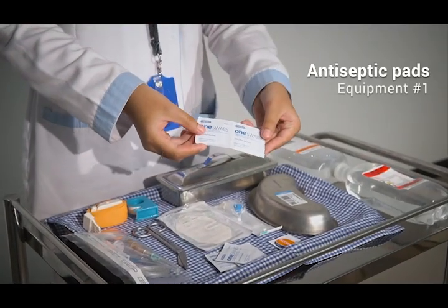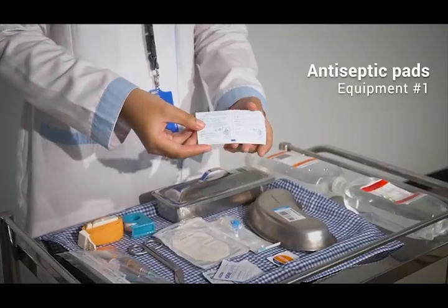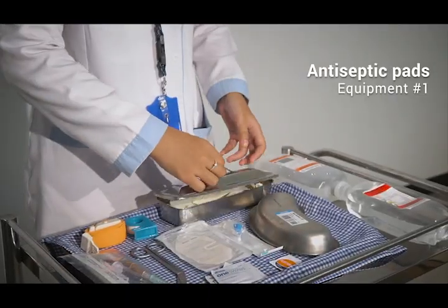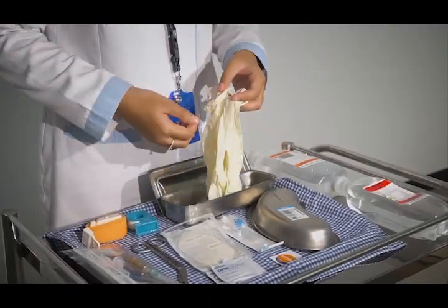Equipment: antiseptic pads, 70% alcohol or alcohol-based chlorhexidine. Povidone iodine may be used if a contraindication to 70% alcohol or chlorhexidine exists.